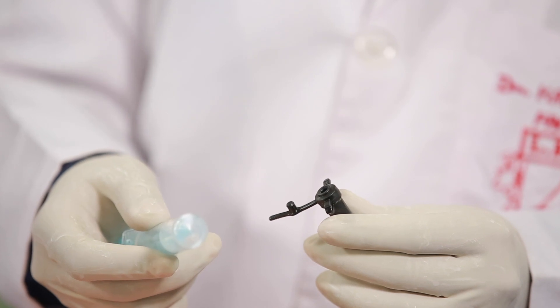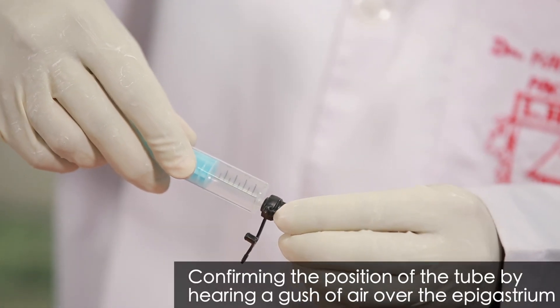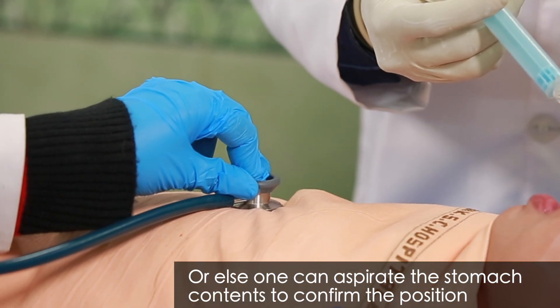It is important to confirm that the tube is correctly positioned in the stomach. This can be ascertained by pushing some air with a syringe into the tube and simultaneously auscultating for a gush of air over the epigastrium with a stethoscope. In case the patient starts choking or coughing while inserting the tube, the tube should be withdrawn and reinserted after the patient has settled. Once correctly inserted, its position can be confirmed by hearing a gush of air over the epigastrium.